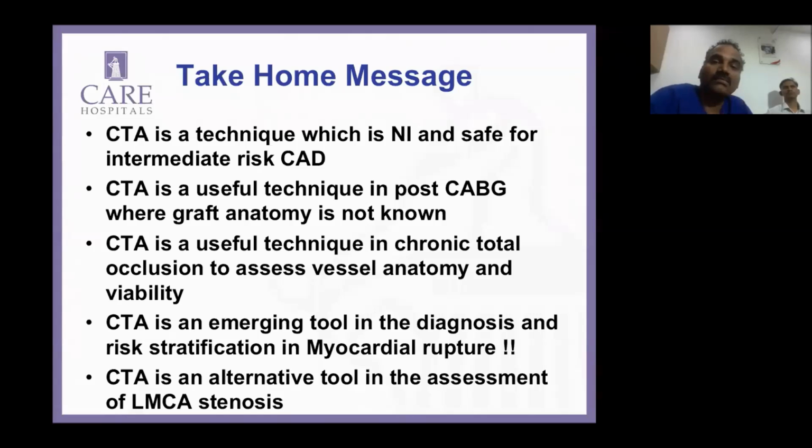So I have one last question, sir. Yeah, Sridhar, go ahead. In a properly interpreted CT angiogram, what is the accuracy of percentage stenosis? We often see in the reports 50 to 60. What is the accuracy?